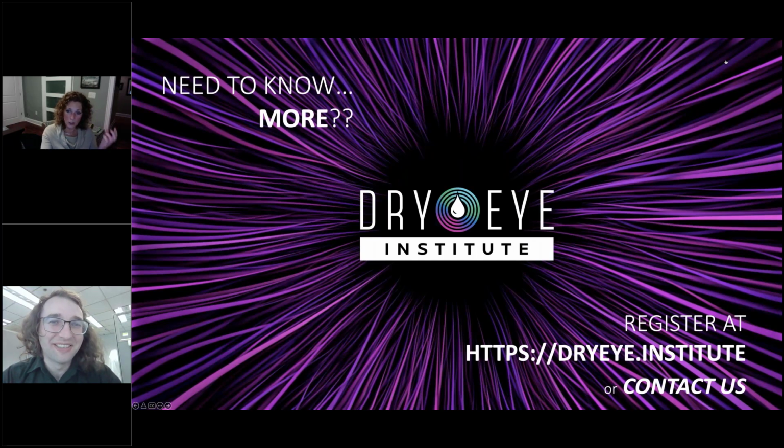If you're wanting to do dry eye, I would start with IPL. And then if you lead into aesthetics down the road, you could add RF, but as a first line dry eye, IPL is going to do better. RF is better at skin tightening than IPL. IPL is better at dry eye than RF.